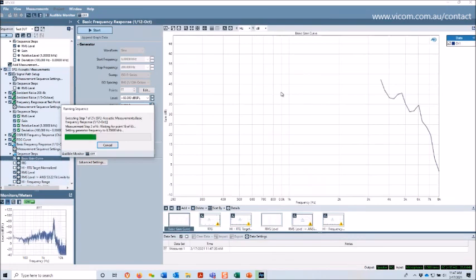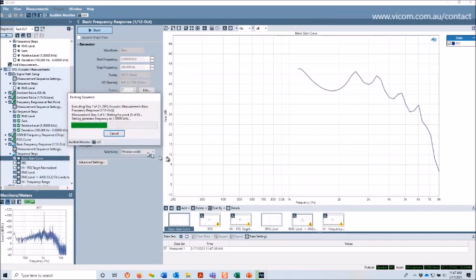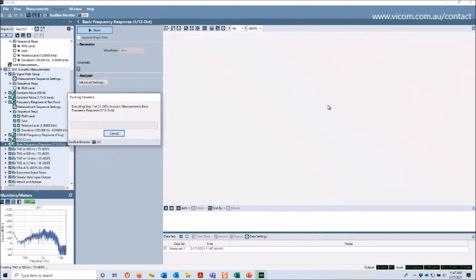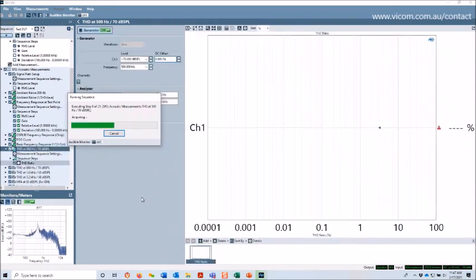And here we're measuring the basic frequency response, again using, I believe, a bandpass frequency sweep with a window width bandpass filter. These are the ANSI limits. I'll try to remember to come back to those, but someone can remind me if I forget.